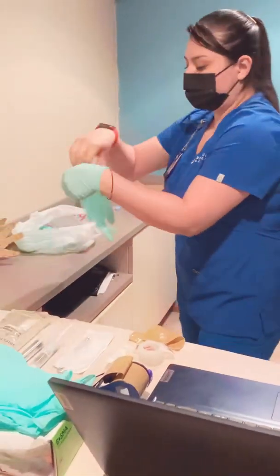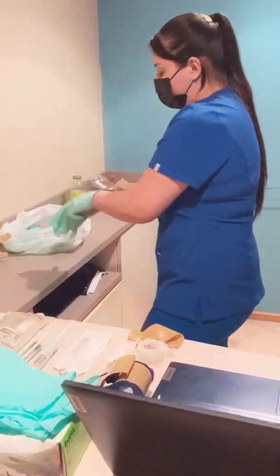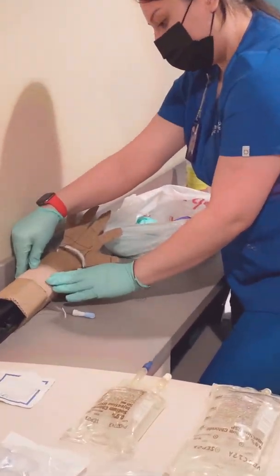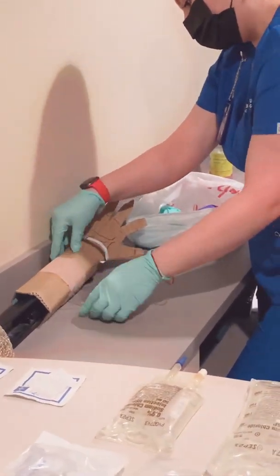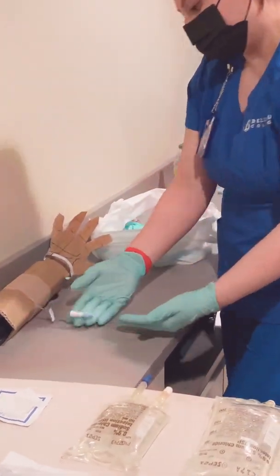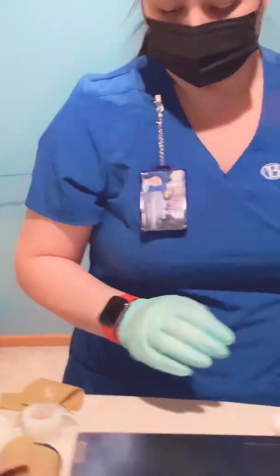So I'm going to grab some gloves, and I'm going to check the IV site. Okay, Tegaderm is dry and intact. No redness, irritation, or infiltration on the patient's arm. The IV line looks good.